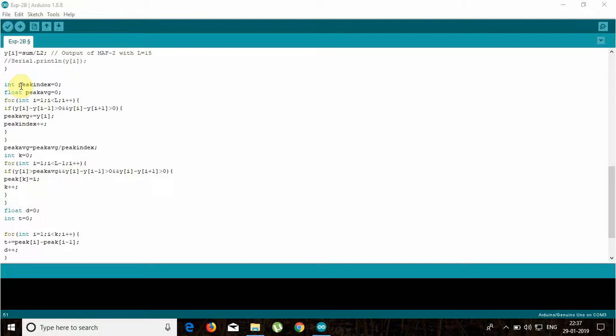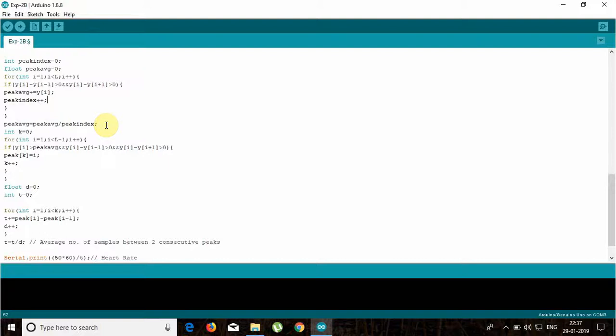And here we declare another variable, peak index. This is for storing the number of peaks detected, and this peak average is for calculating the threshold value for the detection of the peaks. In this loop, we will check for a condition such that a sample is said to be a peak if it is greater than both of its side samples, and we will increase the number of peaks, that is peak index, and then we will add the value of that peak to the peak average, and finally we will calculate the average value of all the peaks. This will act as a threshold for filtering out unwanted peaks, peaks with very little value.